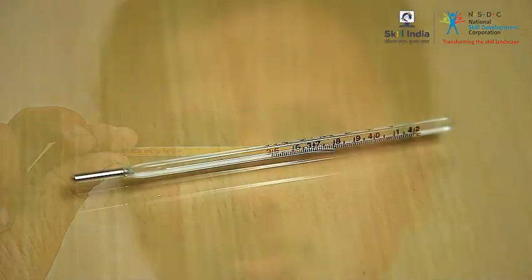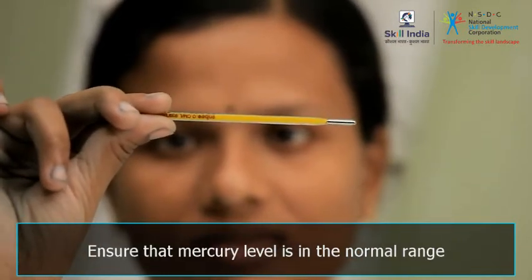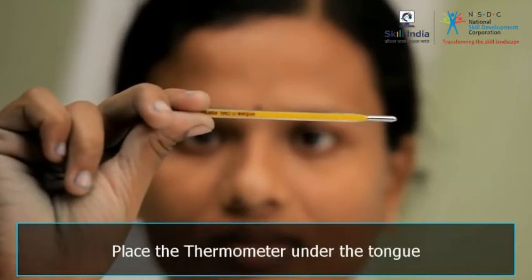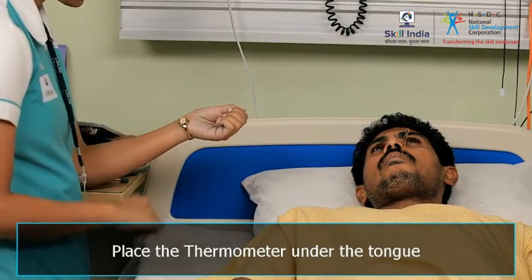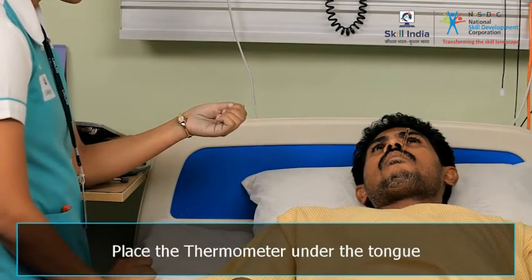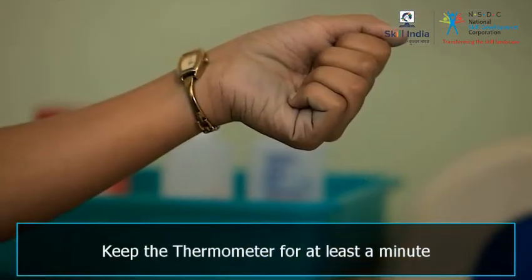See the steps. Ensure that the reading of the mercury level is in the normal range. Adjust the mercury level to normal by shaking it vigorously. Place the thermometer under the tongue and ask the patient to close the lips tightly around it — the person must be able to breathe through the nose. Keep the thermometer in the mouth for at least a minute, and use a watch to measure the time.